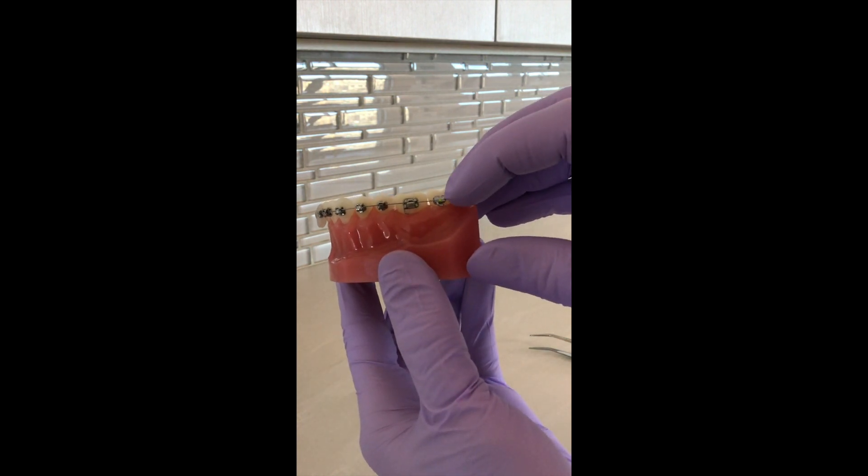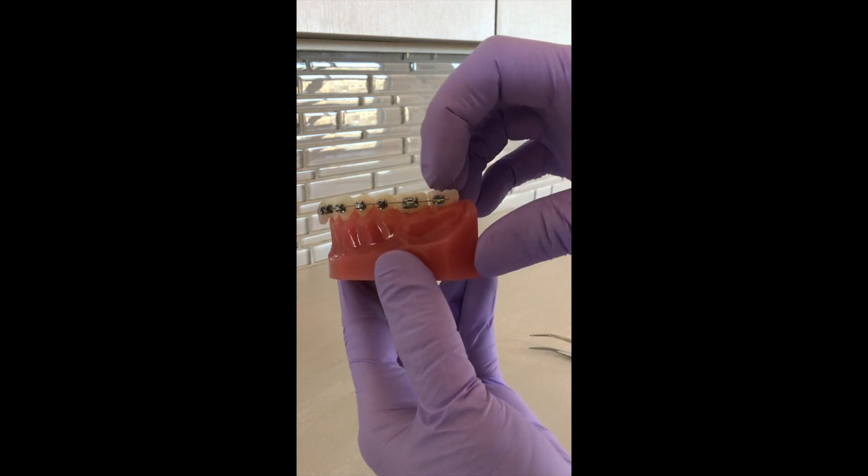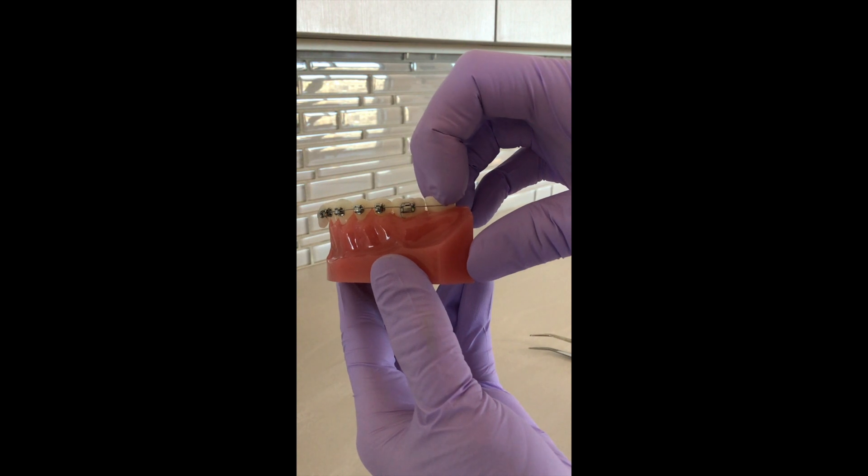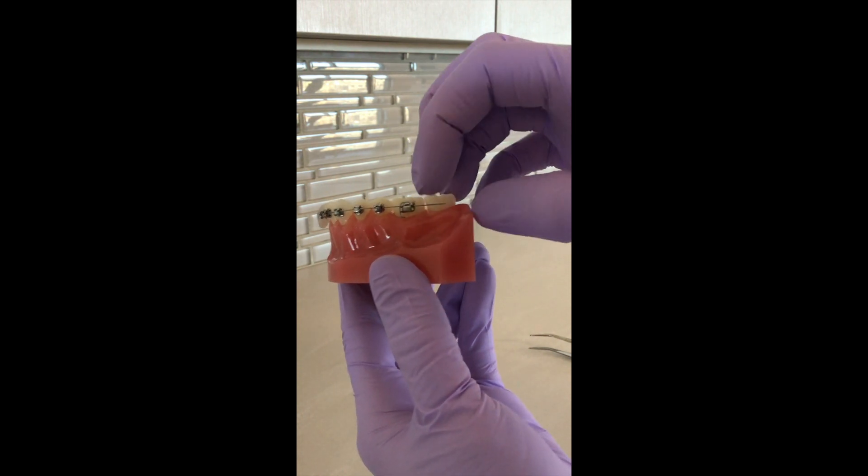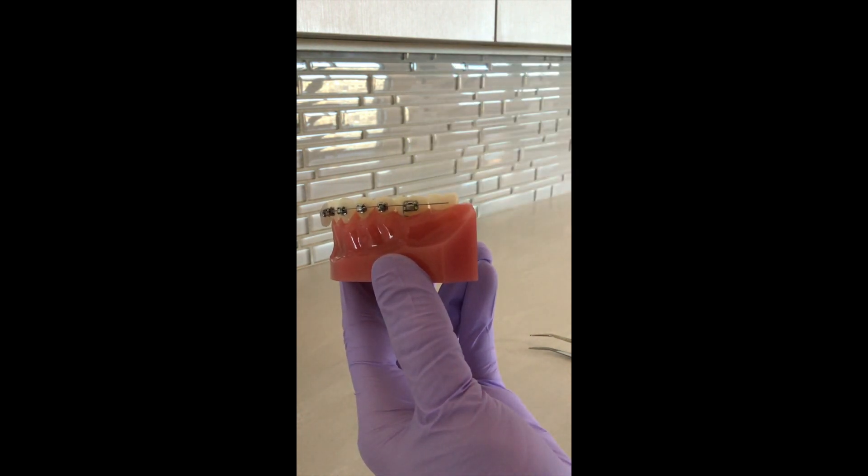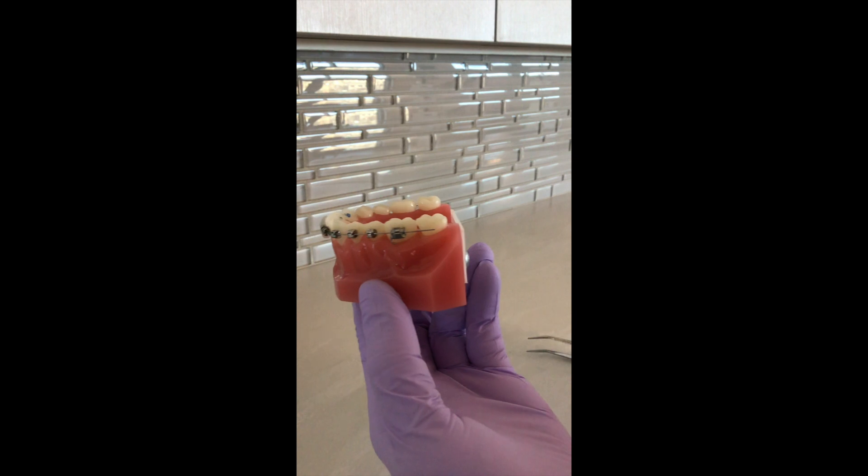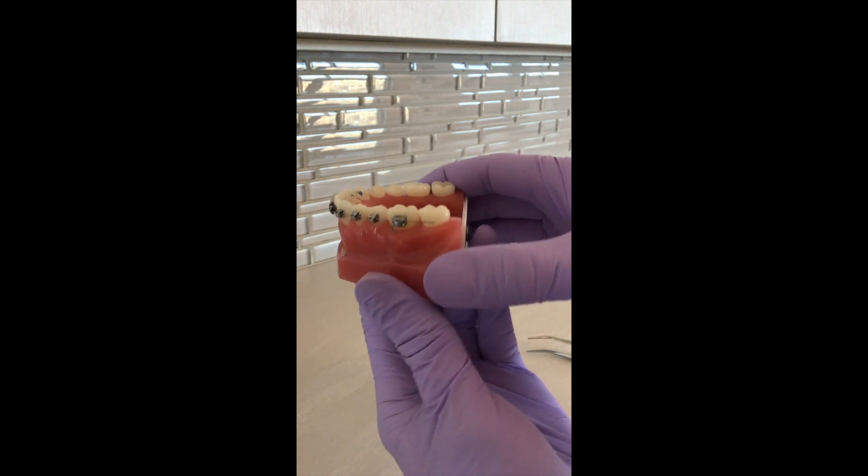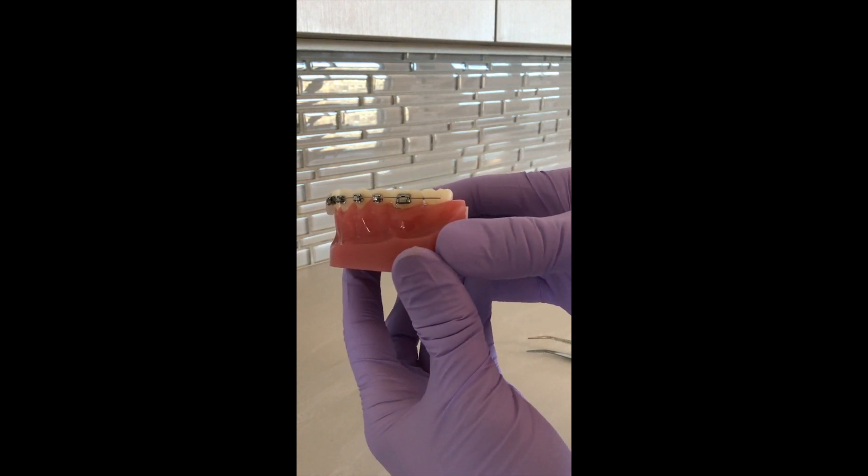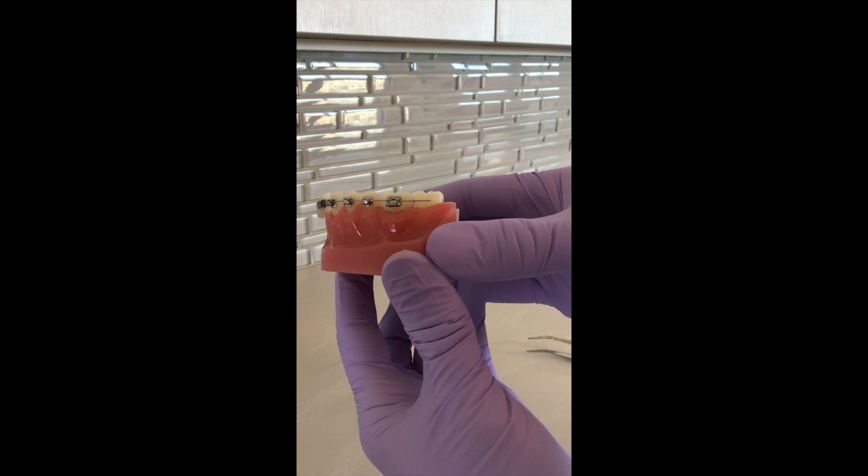probably just fall right off. You can reach back there and slide it off with your fingers or use a pair of tweezers, whatever you have at home to get that out. Now, I recognize that a wire that is that long may start to poke and hurt in the back of your mouth.